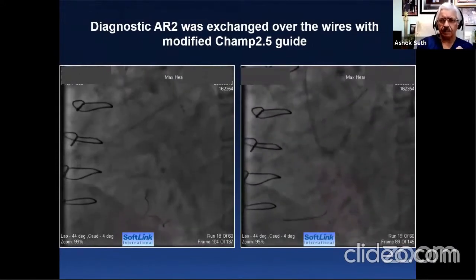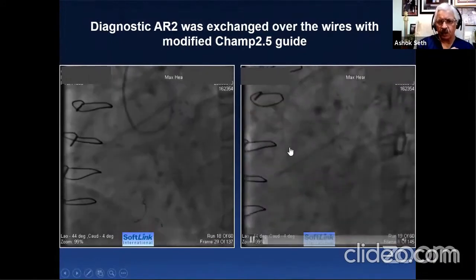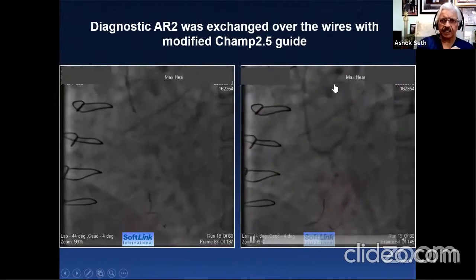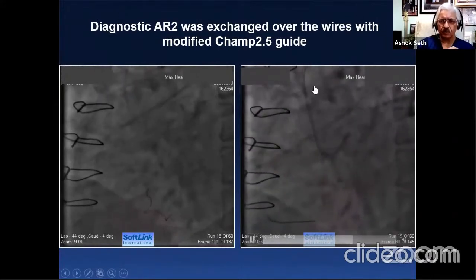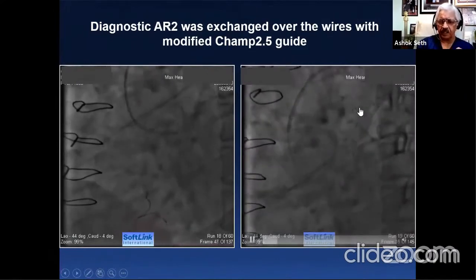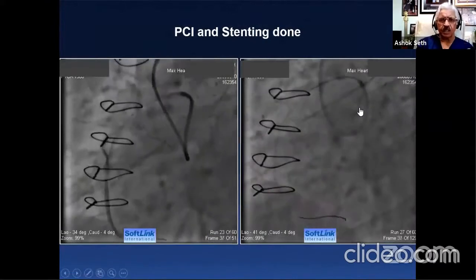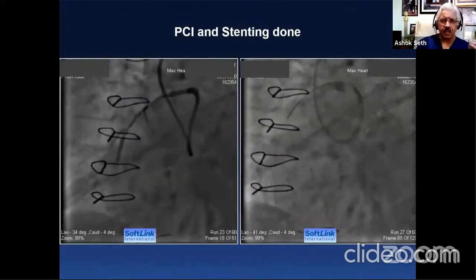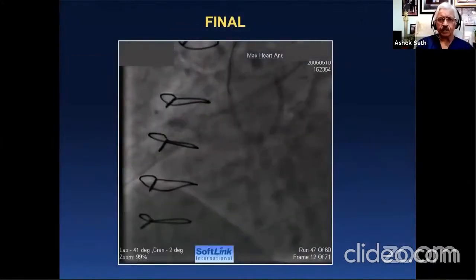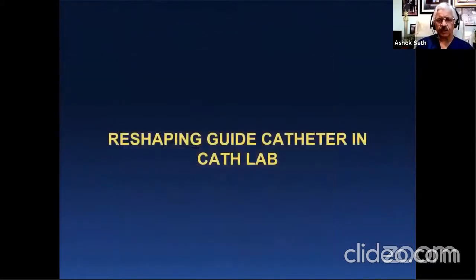And then the remaining part is getting this champ or a modified guiding over this loop and inverting over till it actually fits into the ostium. So this loop is very important in the aorta. And now it fits in fine, coaxially. After that, of course, it's a home run, coaxial fitting. One just then puts in a stent, dilates the vessel, puts in a stent. Of course, got a good result on that. So that's the first trick that I actually do.